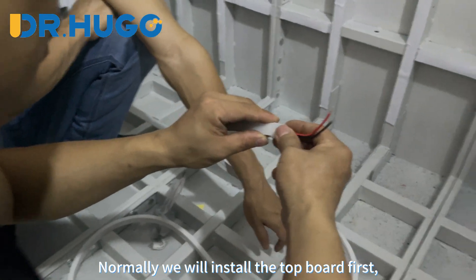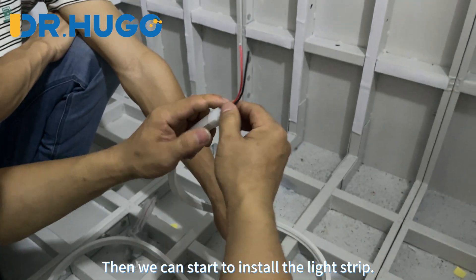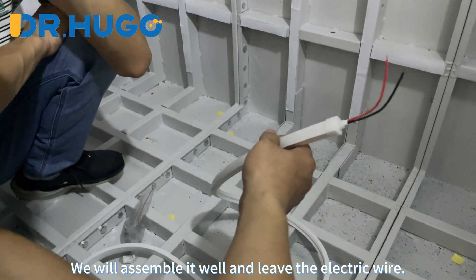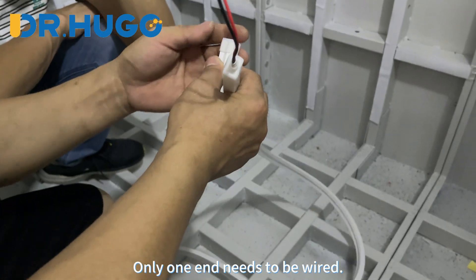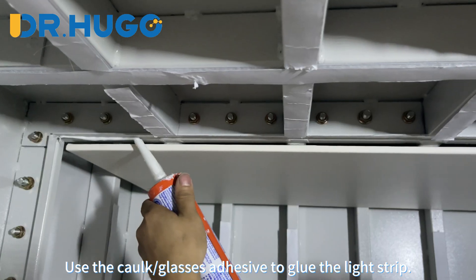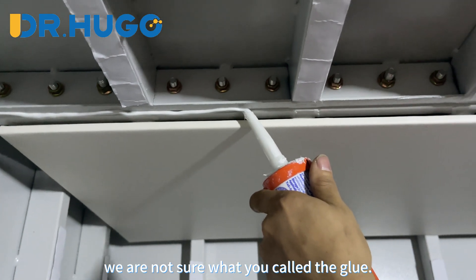Normally we will install the top board first. Then we can start to install the light strip — we will assemble it well and leave the electric wire. What you need to do is connect the electric wire; only one end needs to be wired. Use caulk or glass adhesive to glue the light strip in place.